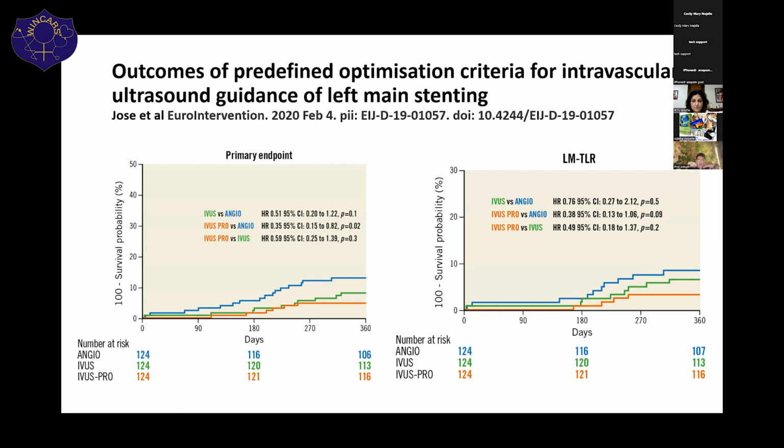Maybe in the future, my take is we look at the ostium of the circumflex if we are doing a distal left main bifurcation. If there are no stent struts across, we don't do anything. If there are stent struts, we try to push them and then do a kissing and try to achieve good results.